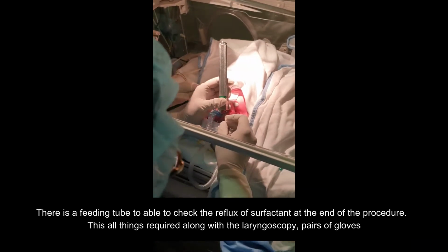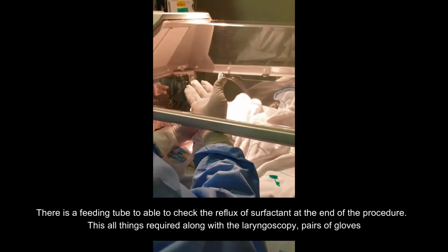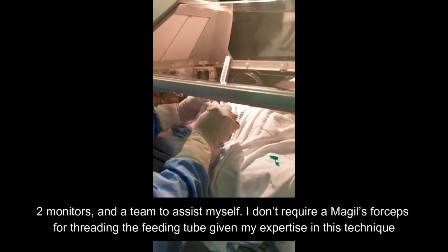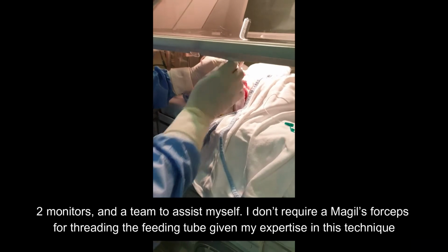Along with this we need a laryngoscope with the correct size of blades, a pair of gloves, 2 monitors and a team to assist me. I don't require a Magill's forceps for threading the feeding tube as I have gained expertise in this technique over the last 2 years.